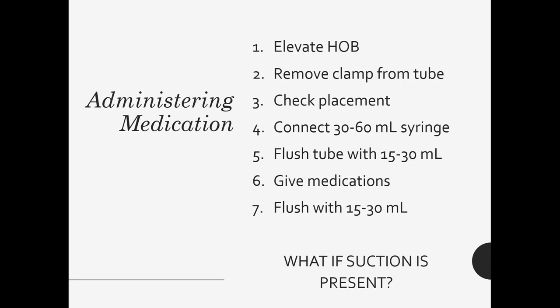So that's how you give the medication. You'll pour those in, let them drain in by gravity, and then you'll flush again with another 15 to 30 mils. So that way it all goes into the patient's stomach and nothing gets stuck in there and clogged up. So you want to flush before and after. Now, if the patient is supposed to be on continuous suction, then we are not going to immediately hook them right back up to suction after we've given meds through their NG tube. Then this will just suck the medications right back out, and they won't get the effects of those medications.